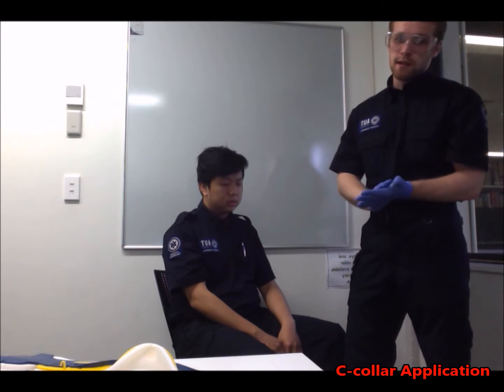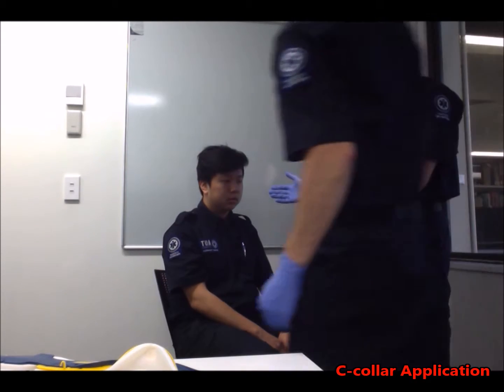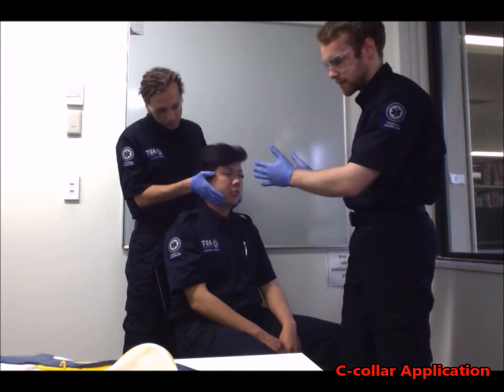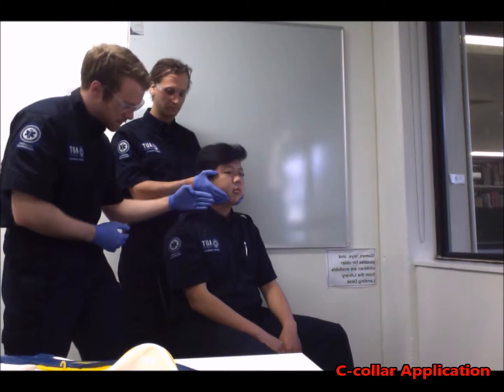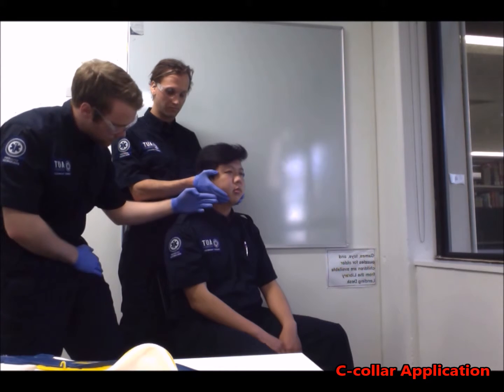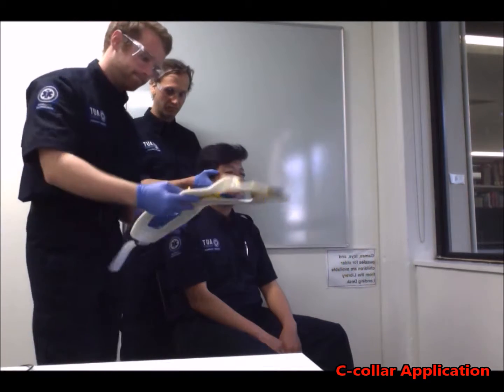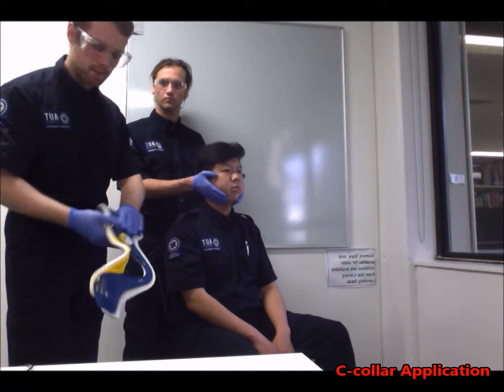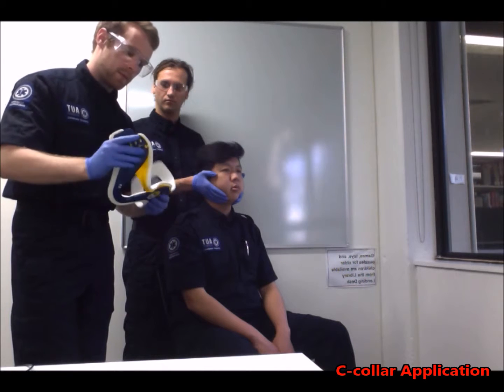To do this, we'll need a person to come in and stabilize Bruce's head. So it's a firm application of the hands holding the head tightly. Next, I'm just going to measure with my hands the size of C collar that Bruce will require. So it's three fingers. So I bring up my C collar, measure. So checking the size here, Bruce is a no neck. We're just going to bend this so it can be applied more easily.